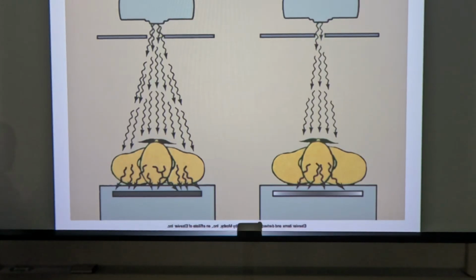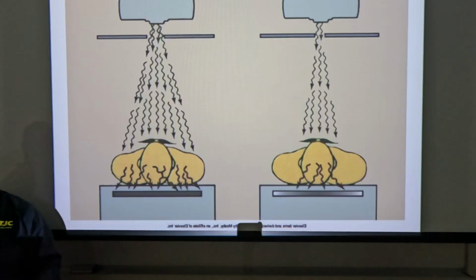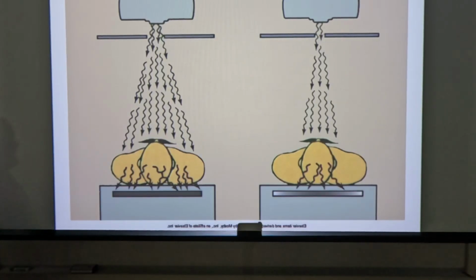So it went from almost strictly, at its inception, strictly an ethical and moral issue to reduce the amount of radiation to the patient, to that plus affecting your contrast, because if you hit more tissue, you create more scatter radiation, reduce your contrast. And now it's really pretty much back to just a moral issue, right? So you reduce the amount of tissue that you expose.